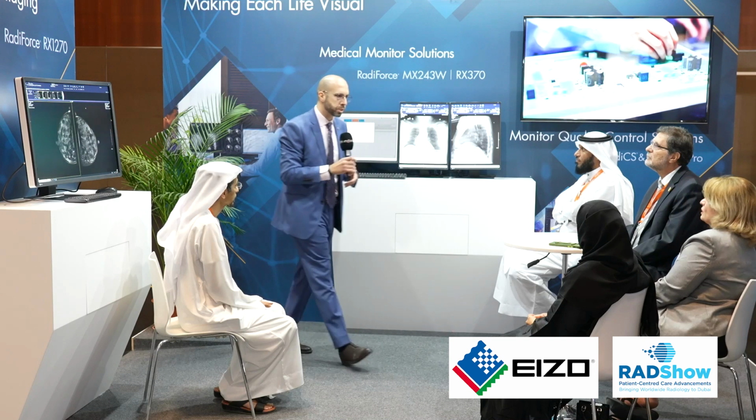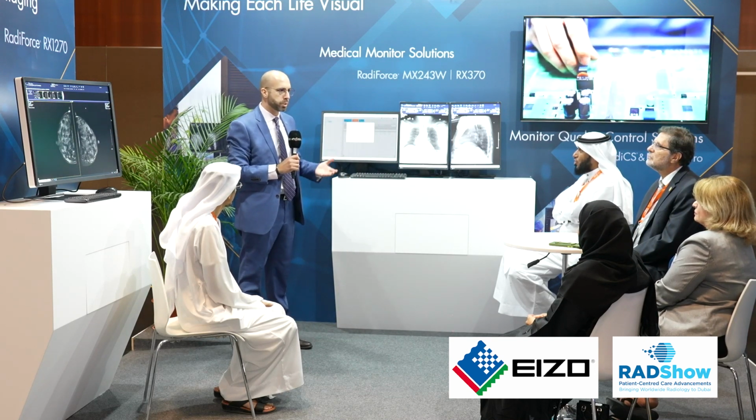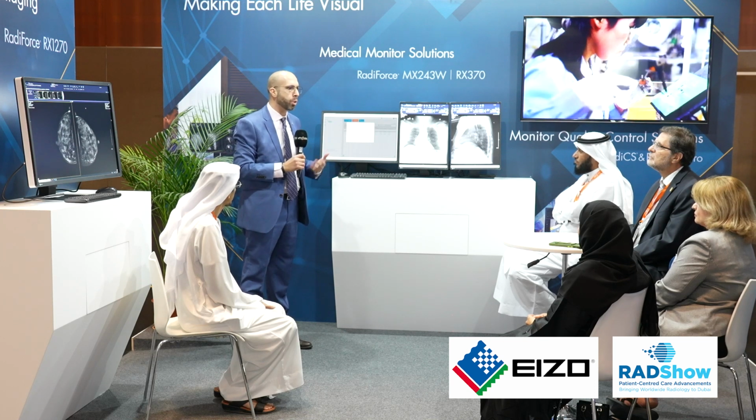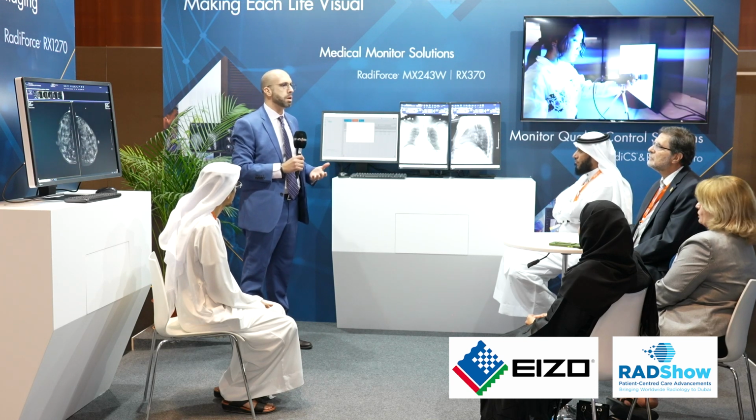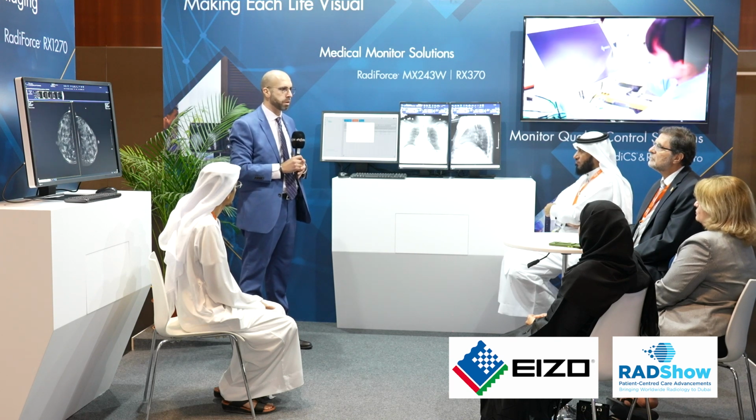Thank you, doctor, for your questions. Usually the calibration should be done twice per year or one time per year, depending on the workload on the monitors. But two times per year is the perfect frequency.